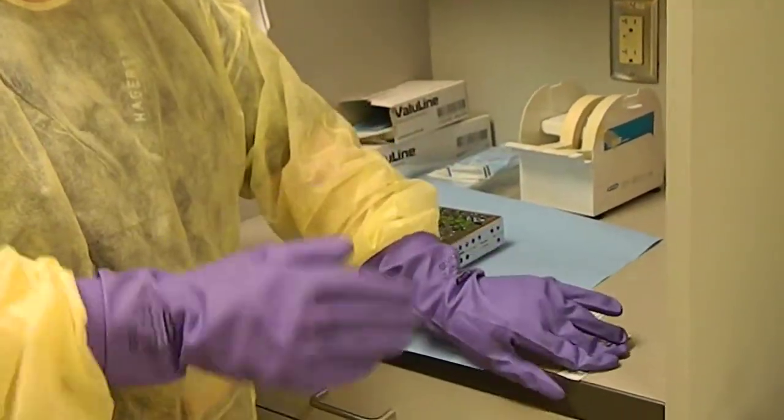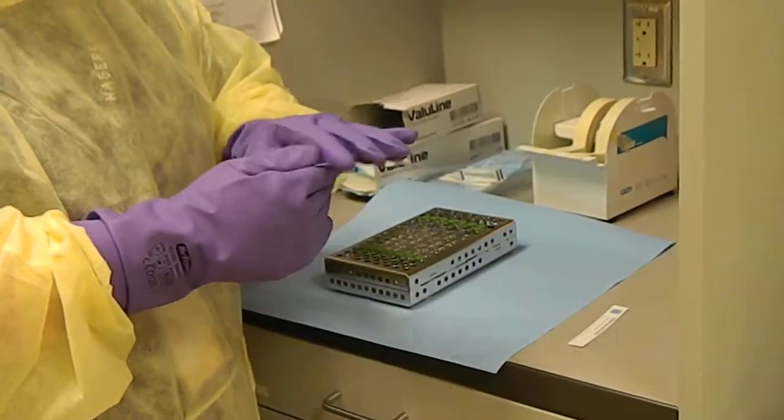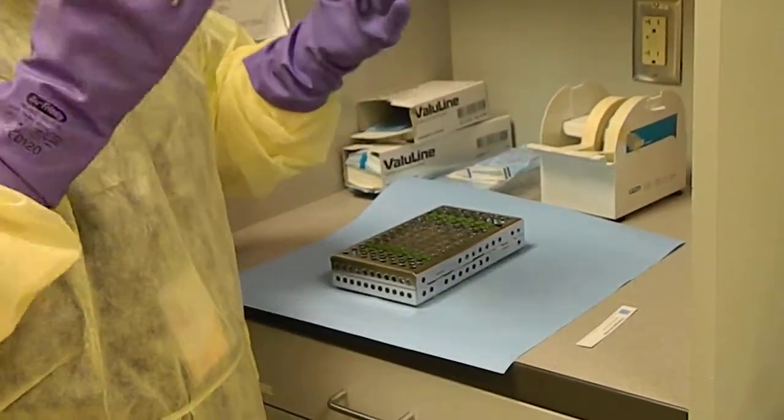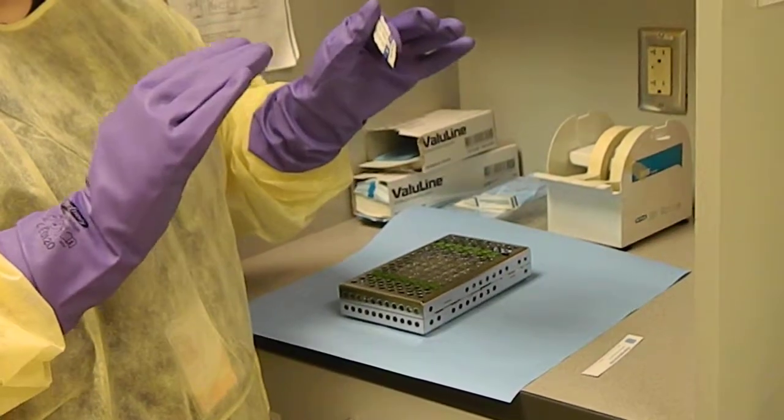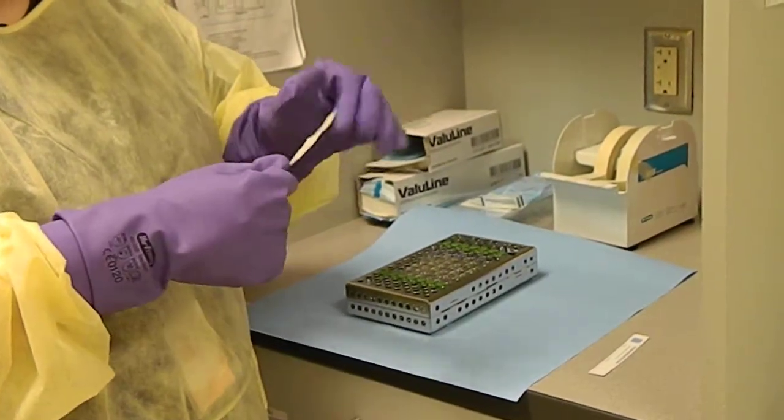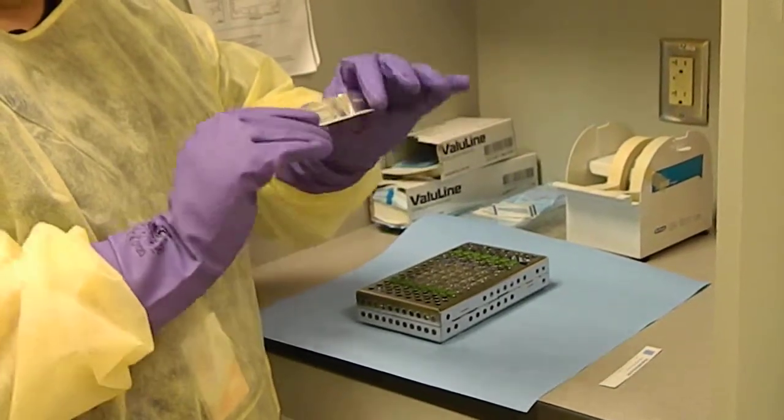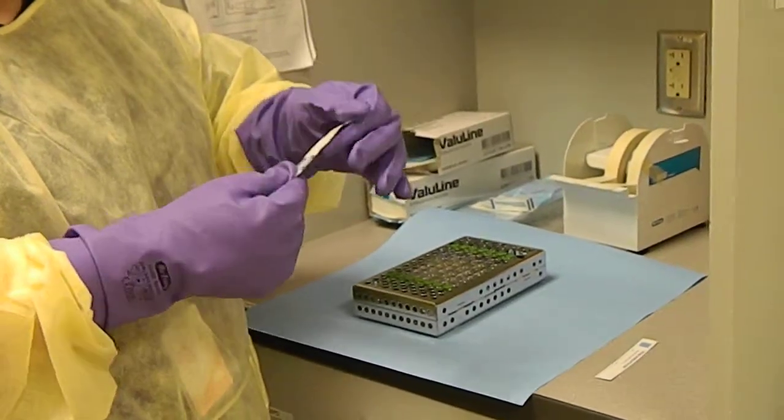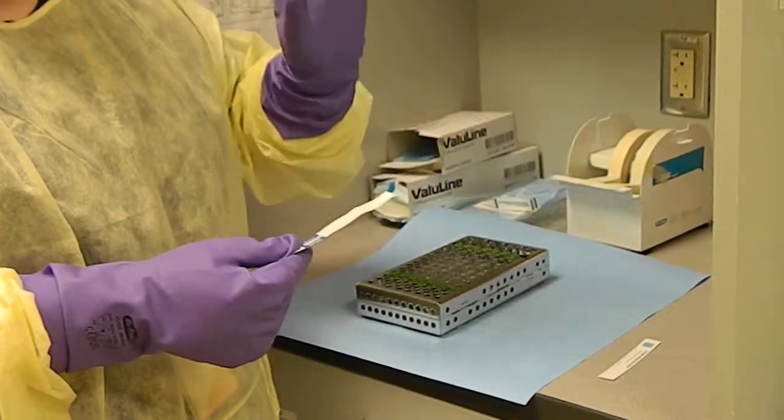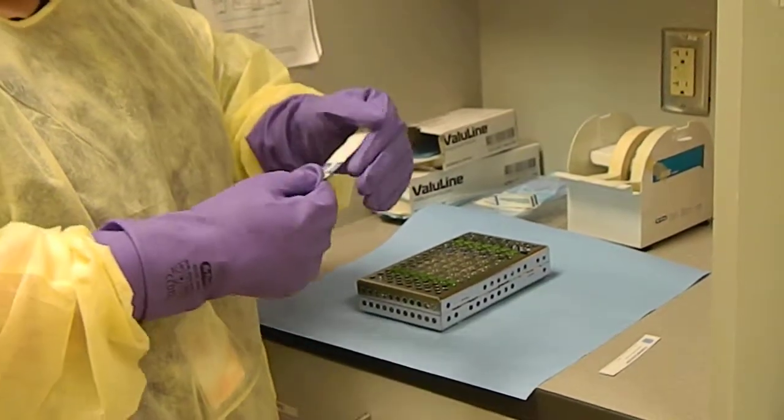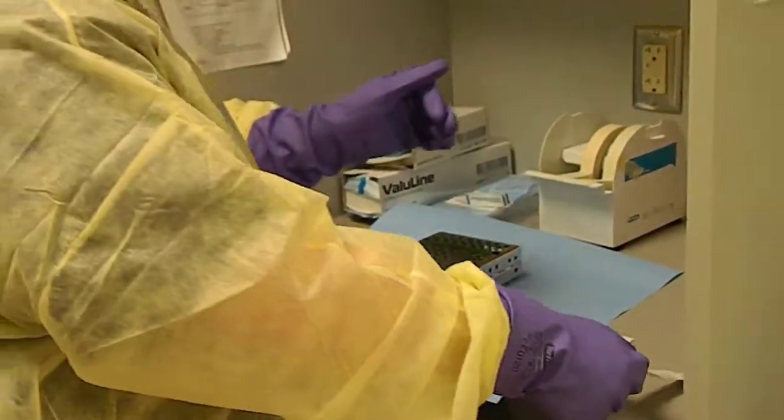The other one is for use with the autoclaves and the statums and this shows that the steam and the heat reached a certain level inside of the machine that's sterilizing. So that is our integrator strip and it has a metal backing. So make sure you put the right one inside the cassette and the right one inside the autoclave. And we'll talk about this one shortly here.